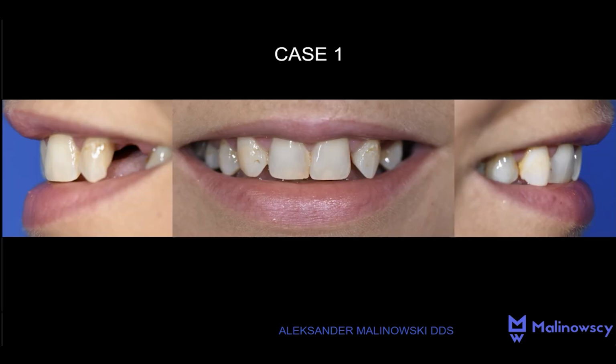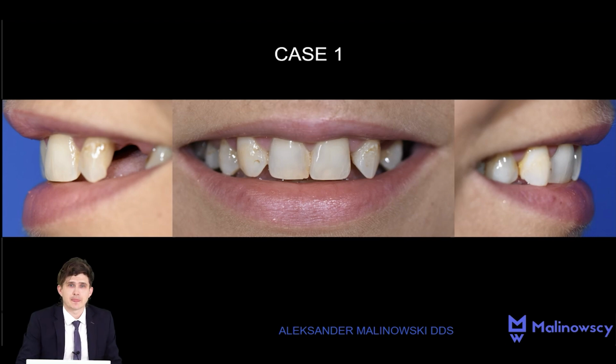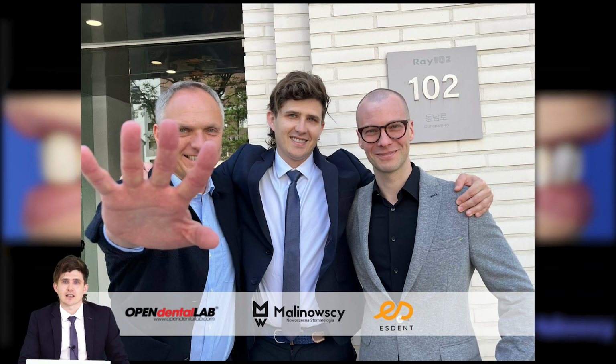I have been working with the facial scanner for the past year and a half. It has been a challenging period, yet incredibly inspiring, completely transforming my perspective on prosthodontics. This advanced tool has revolutionized my methodology and treatment process, enabling me to achieve significantly better outcomes, both functional and aesthetic.